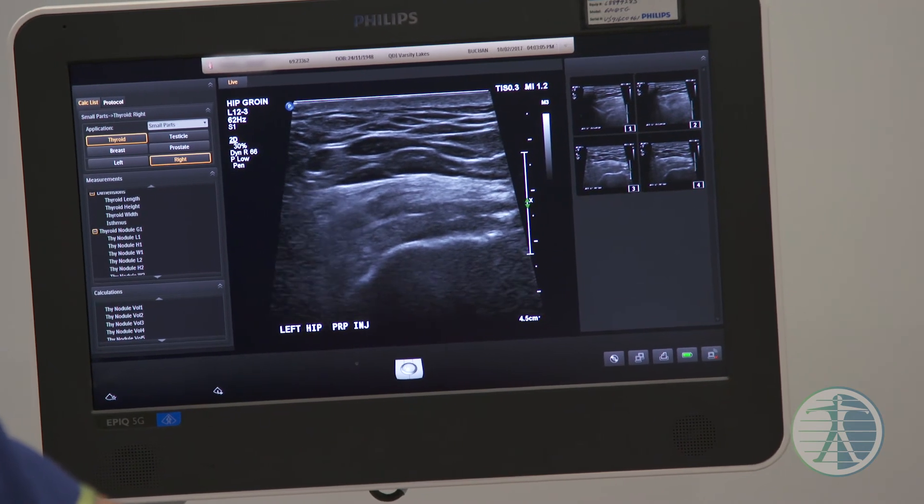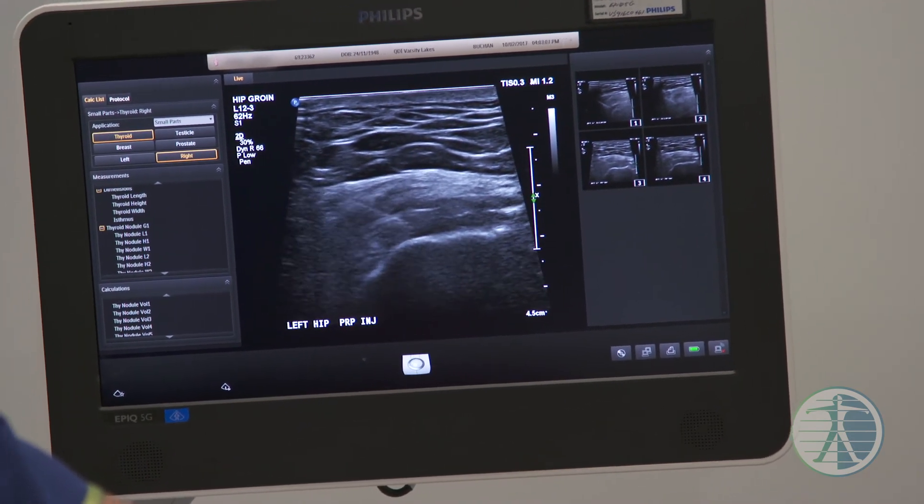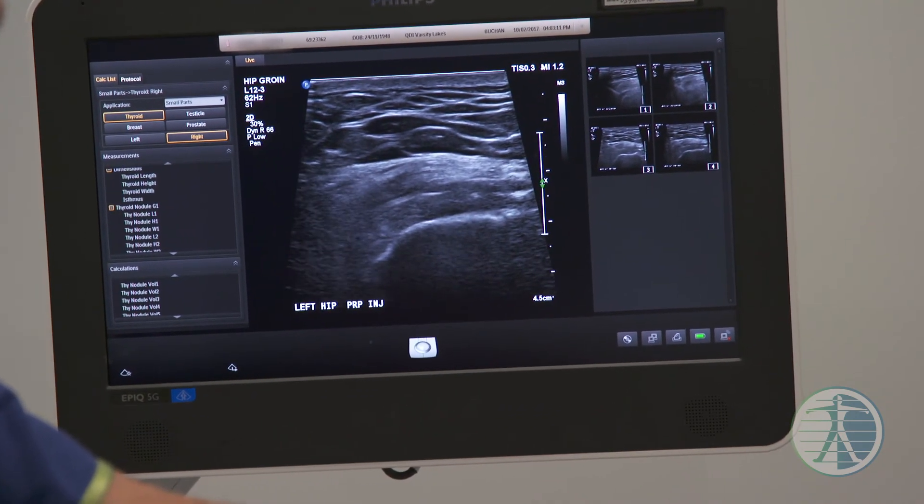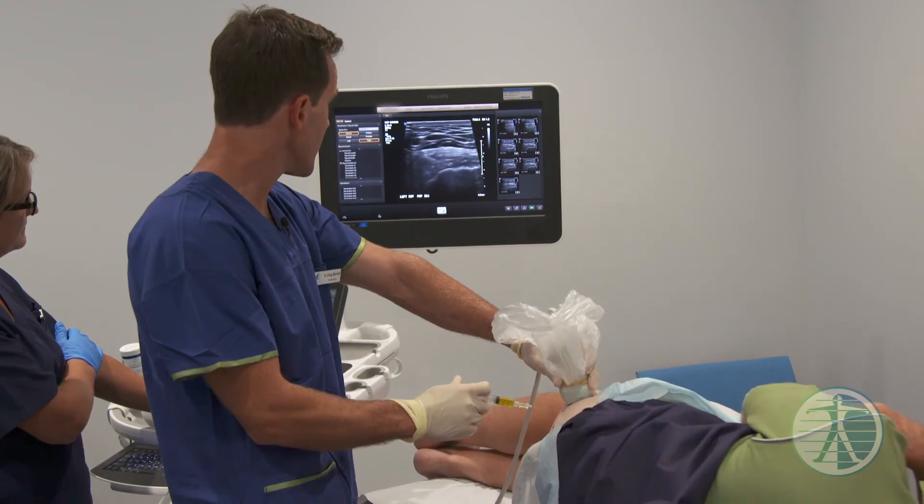What we do is called fenestration, where we make a couple of little holes in the tendon — it's not normal — and I'm just going to make a couple of little holes right where exactly we thought it was sore.